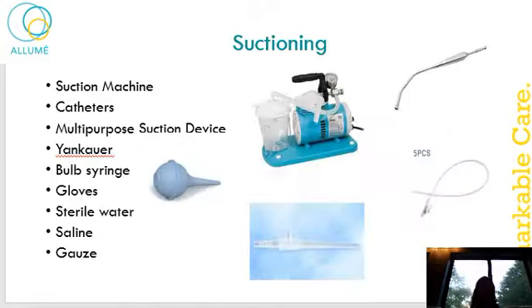The next intervention is suctioning. Every patient should have at least a bulb syringe in case they need to be suctioned. We don't want anybody to aspirate. On my picture, you can see in the middle is a suction machine, which most of our patients do have. You would need to use a device like on the right side of the slide, the Yankauer or the open suction. There's a little nose sucker on the bottom, which is really good for the smaller babies or toddlers.